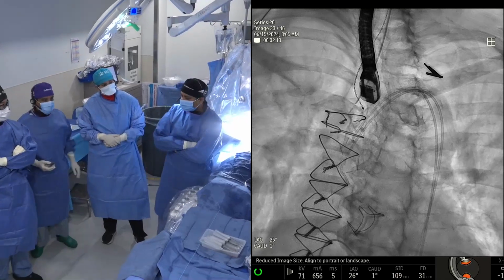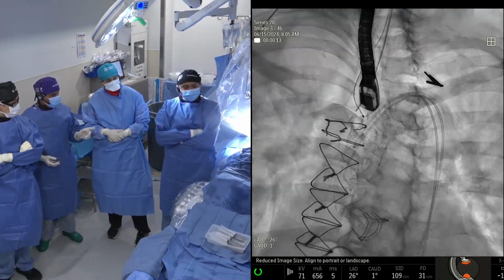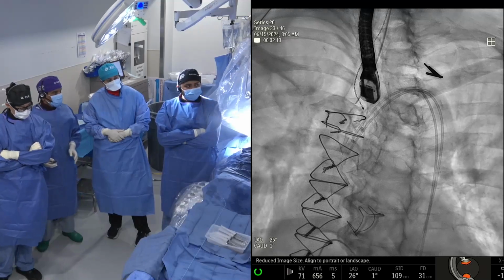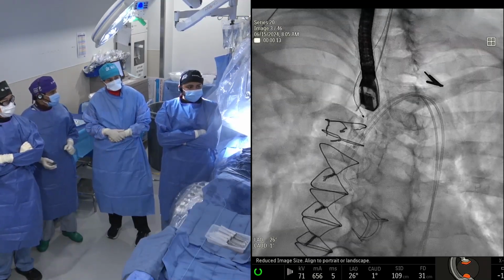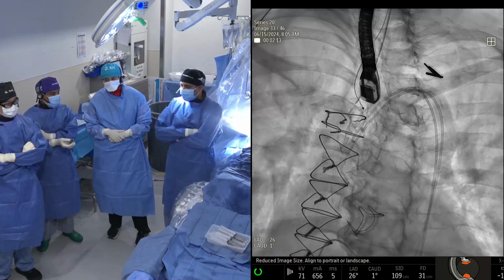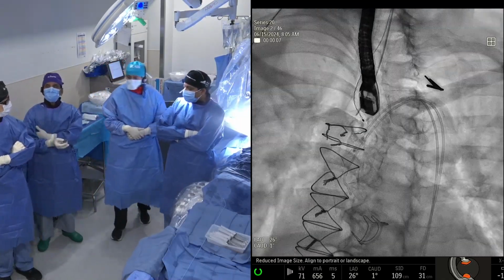So therefore, this is a two-stage approach on this case. I know you are following this patient. Is there any dehiscence of the aortic valve, or is it just regurgitation with the degeneration? Knowing the surgical valve has been for about 11 years now. No dehiscence, mostly is aortic regurgitation with valve degeneration.